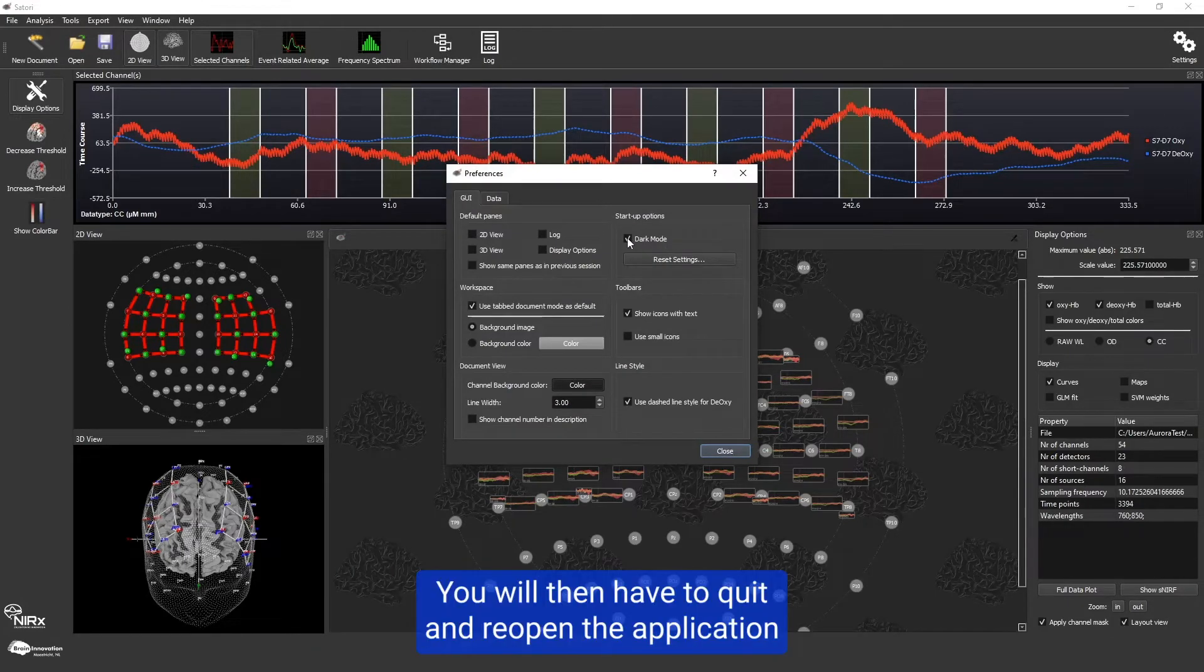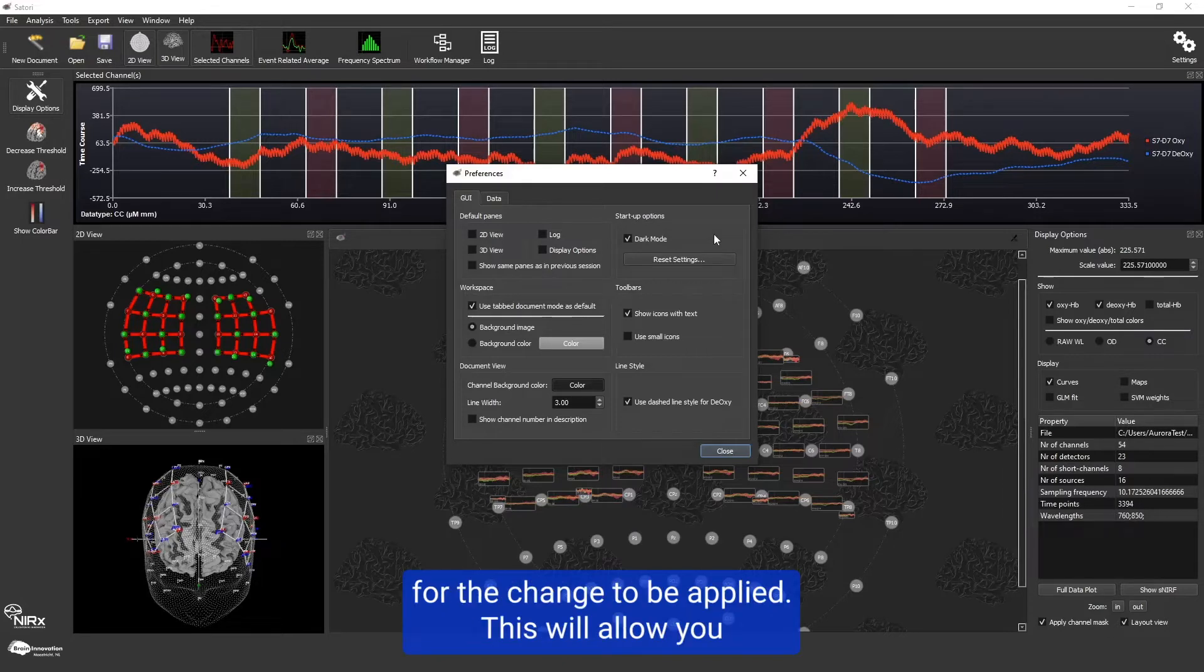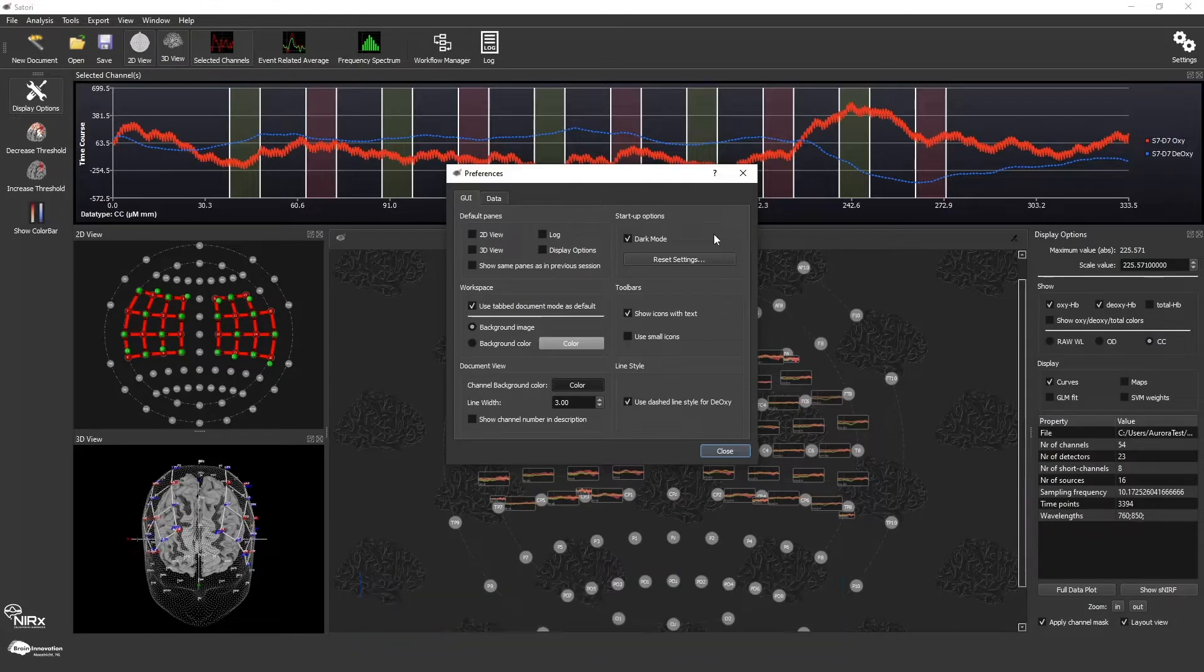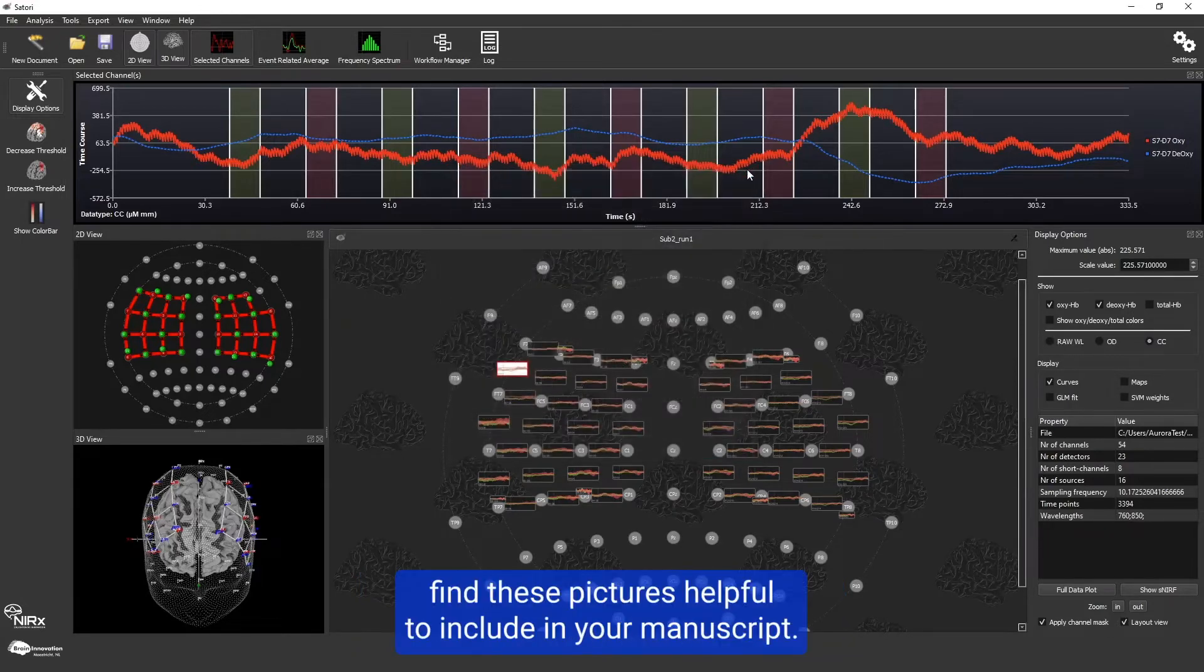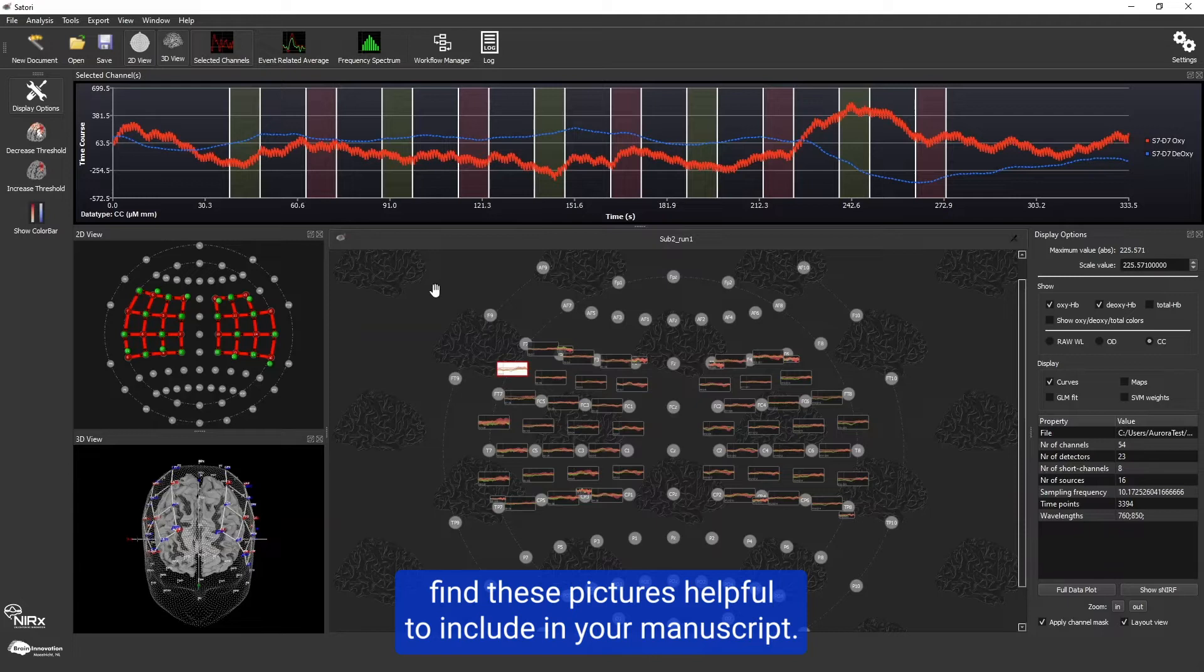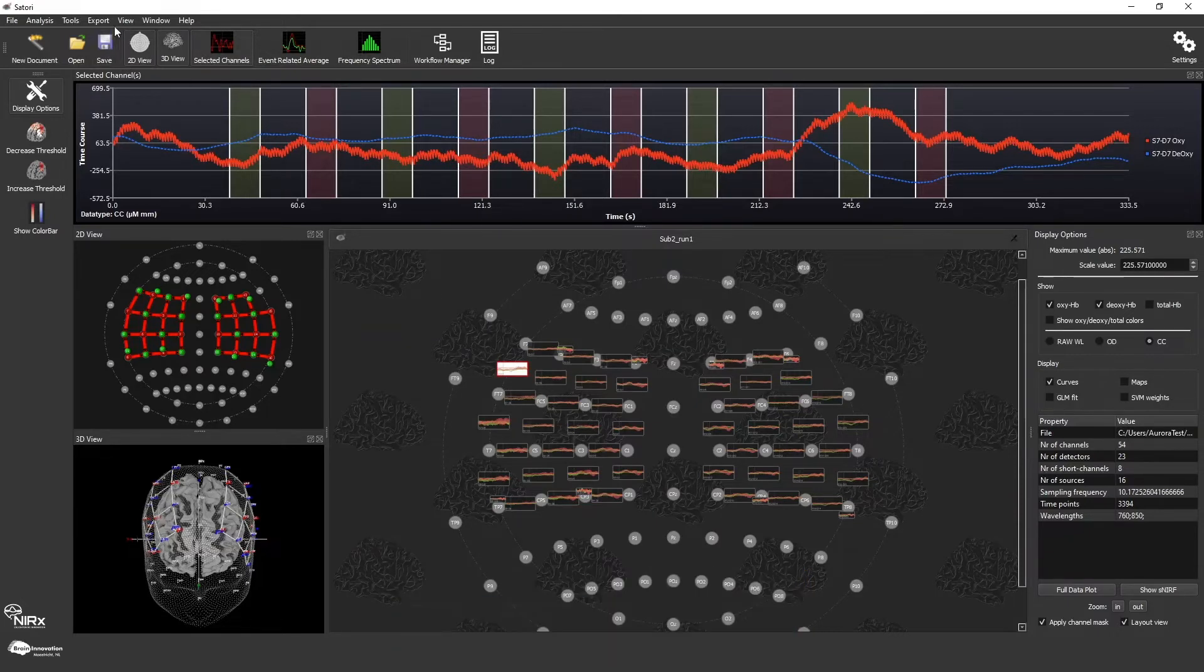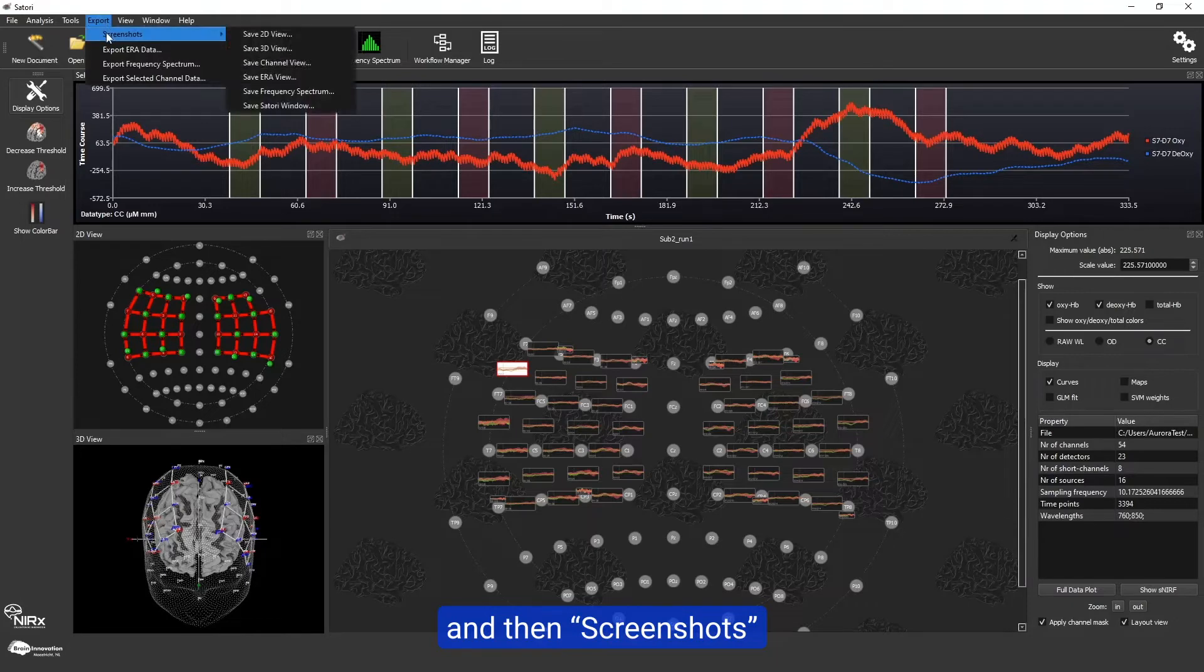You will then have to quit and reopen the application for the change to be applied. This will allow you to have the appropriate background color for your pictures. You may find these pictures helpful to include in your manuscript. The different images you can save are in export and then screenshots.